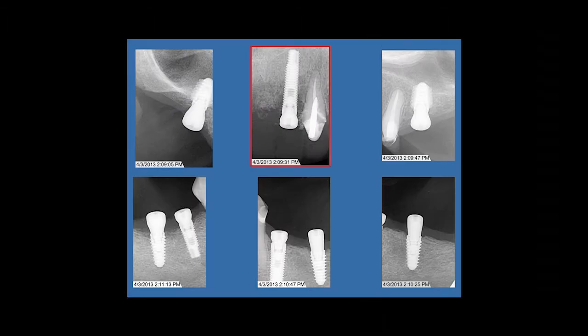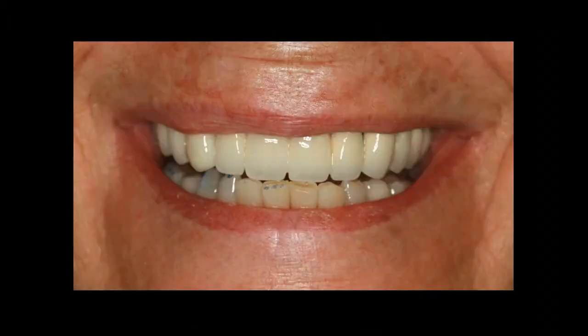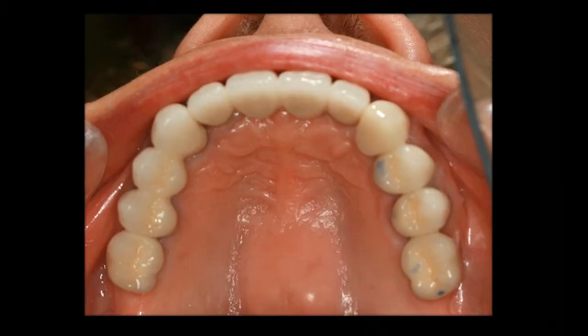And that's what we did. So here's our AnyRidge implants on the bottom, tapered screw vent, AnyRidge, tapered screw vent, AnyRidge. Today, I do all AnyRidge. And so here's an after shot of everything in place. All of this is healed. It's been in provisionals a long time. Then we come back and put our implants in and our provisionals. This is after. I'm sorry I don't have a shot of the lip raised up. That's before. That's after. Before and after.